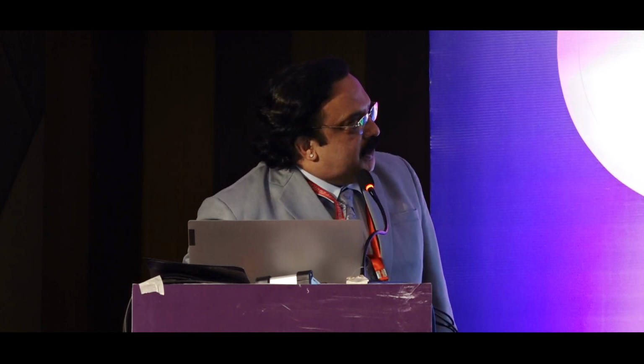So what we have done is, this is the defect size. On the left, see, we have put a graft there just below the plate, and we have fixed it with 2 screws. Graft is stable. And this is the final result in bilateral. We have done it in a single sitting.